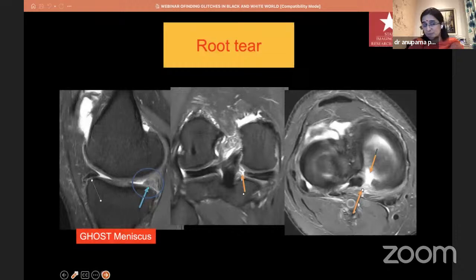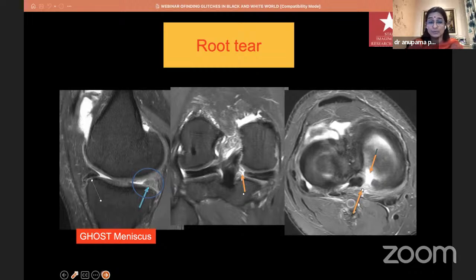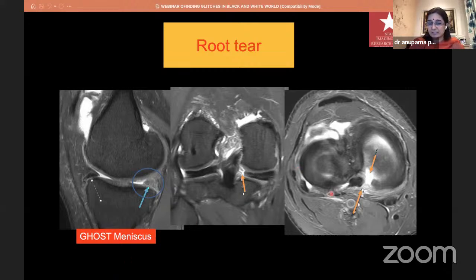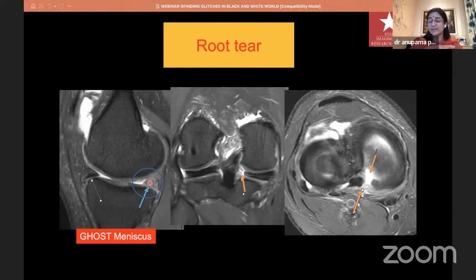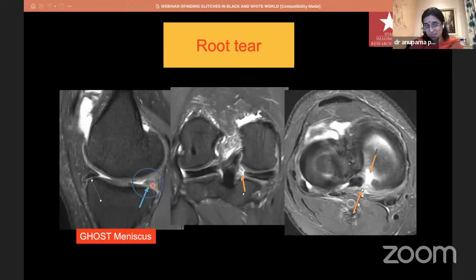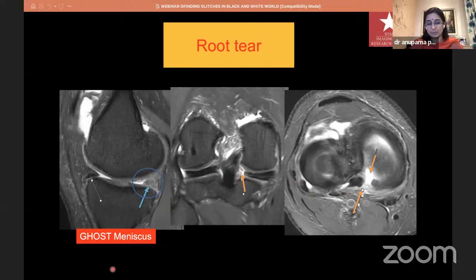Root tears are special types of radial tears that are most often missed. On sagittal imaging, the ghost meniscus sign — though beautifully described in multiple articles — is often missed by radiologists because it is so close to the center that it can get mixed up with fat and the PCL. You see the anterior horn but nothing posteriorly — that is a tear. On coronal imaging a gap is seen at the tear, and on axial images it is absolutely beautifully seen.